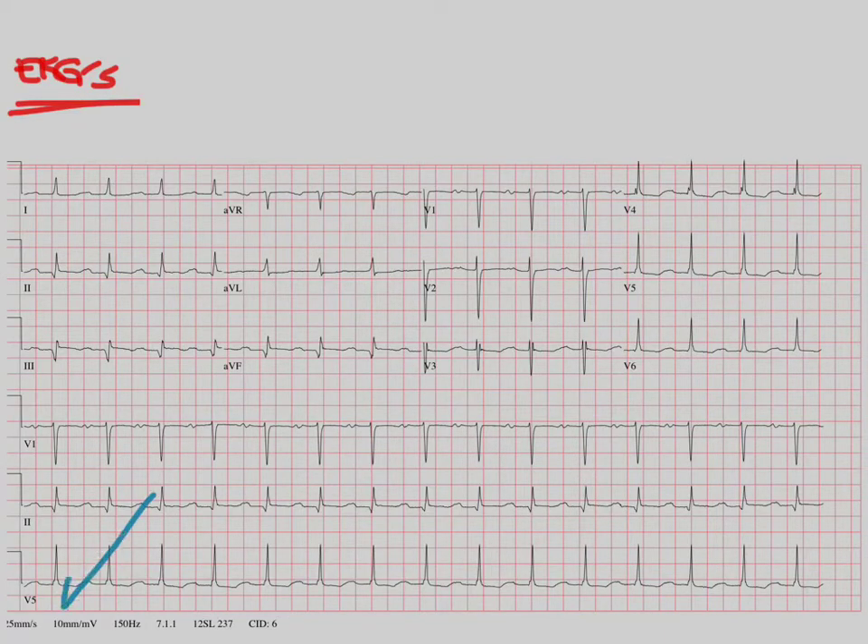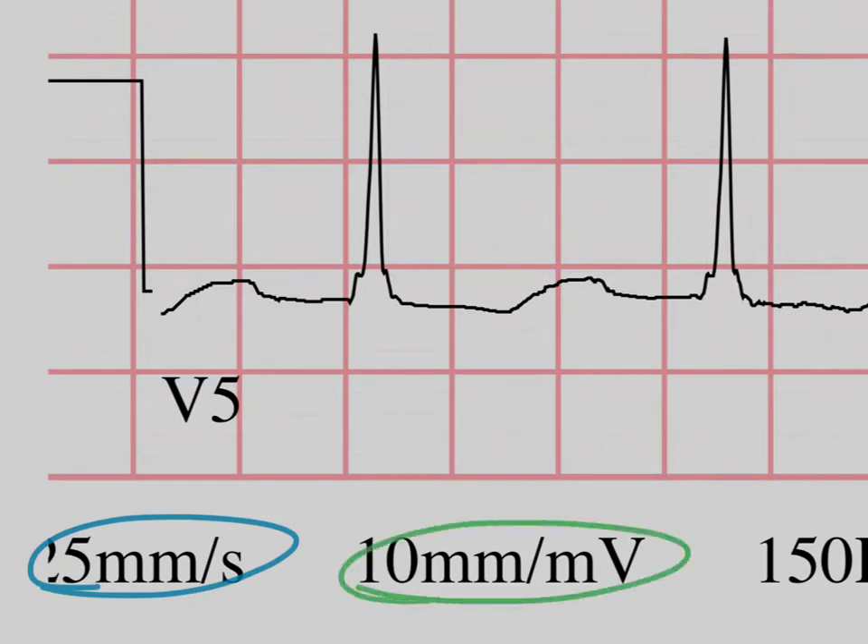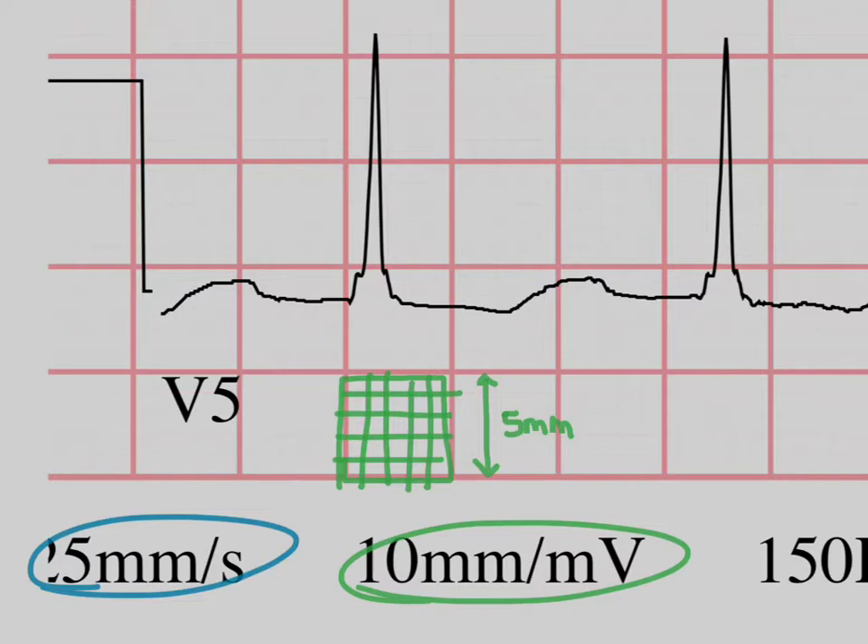The first things we're going to look at are those numbers down there - the things you probably never pay too much attention to. The two numbers we're looking at first are 25 millimeters per second and 10 millimeters per millivolt. Looking at the boxes, this is one big box, split up into five smaller boxes. Each one of these small boxes is a millimeter, so one big box is five millimeters. If 10 millimeters is a millivolt, that means two big boxes is a millivolt - that's the amplitude of one millivolt.